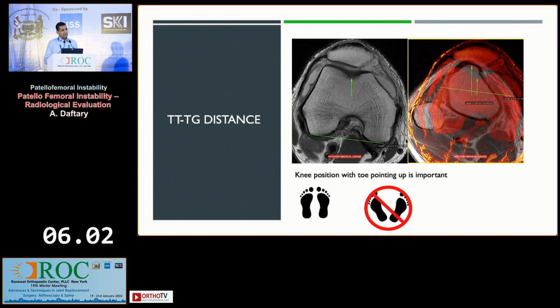When people go into an MRI scanner, as mentioned before, there is a certain degree of flexion. There's also a certain degree of packing that we do. So we get people into an MRI coil, we put packing material around them to make sure that the knee doesn't move, and this will also change alignments.